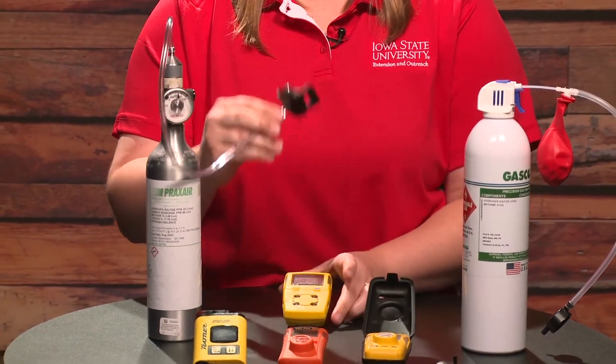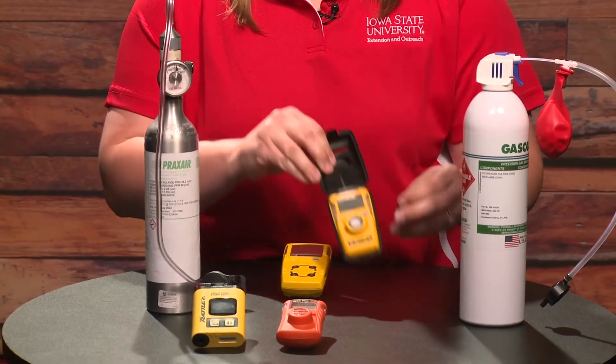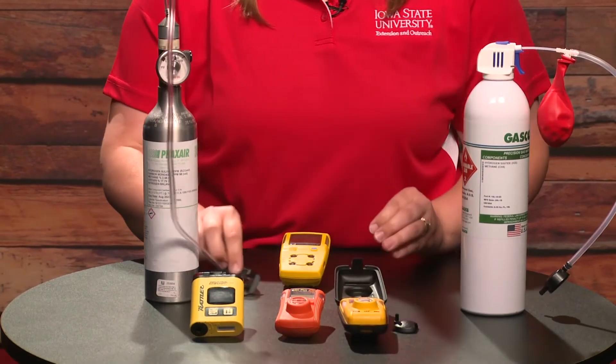I believe this calibration cap came with the unit, just as this one came with the unit. So don't throw this away — this is the calibration cap to use.